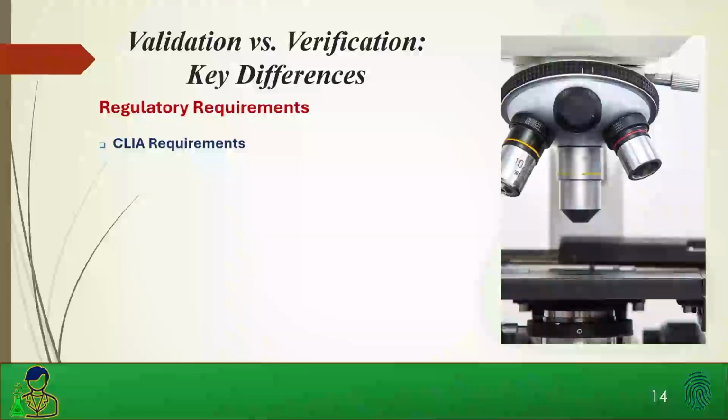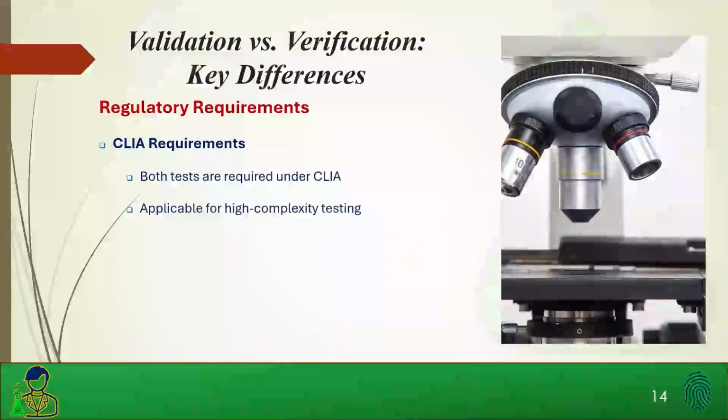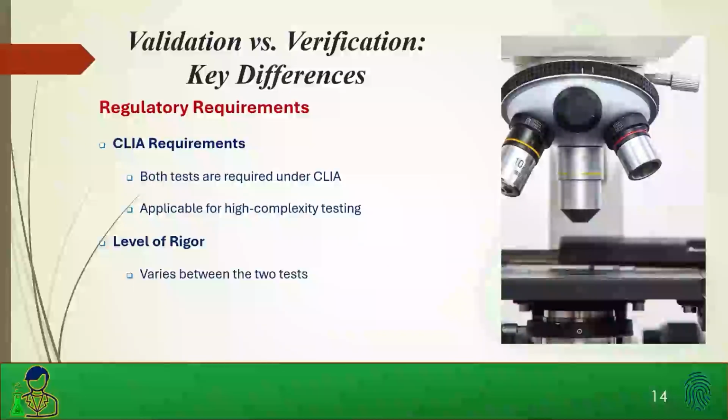I just think that's what the slide was going to be. CLIA requirements. Both are required under CLIA, applicable for high complexity testing. The level of rigor varies between the two tests. And there are different documentation standards.